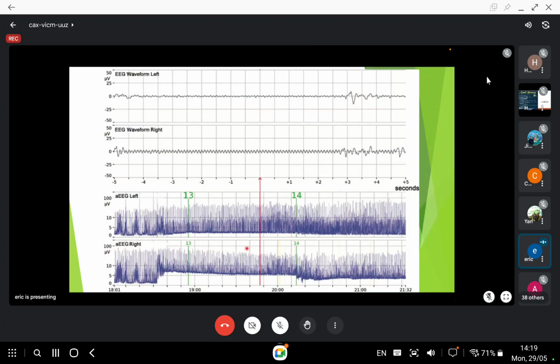waveform. So this one you can see rotatory like this, right? So what do you think it is? Okay, this is a transmitted waveform from the HFOV. And when you see that, you can see actually there's a drift in the baseline upwards. Okay, go up like that. Okay, and that is just an artifact from the HFOV.